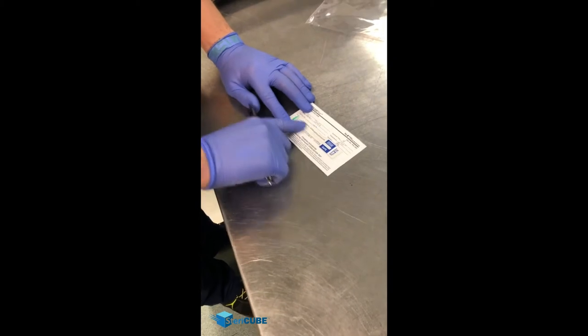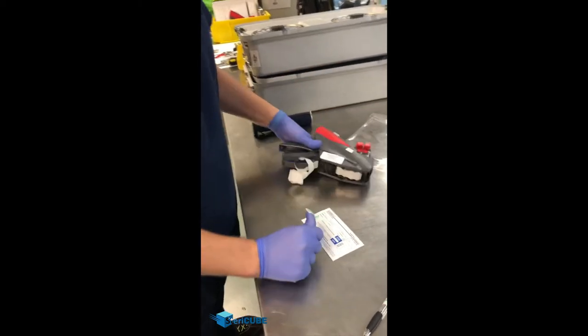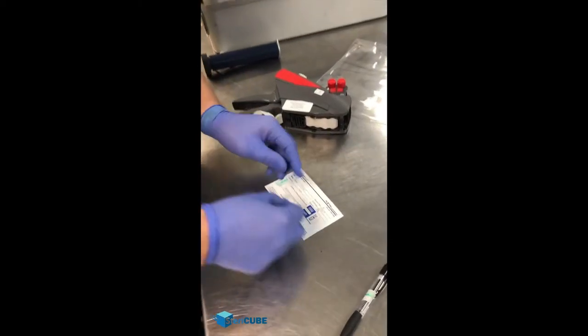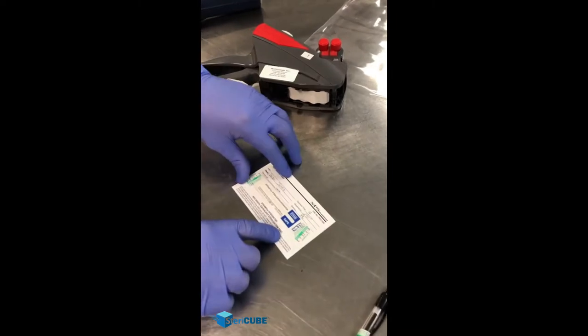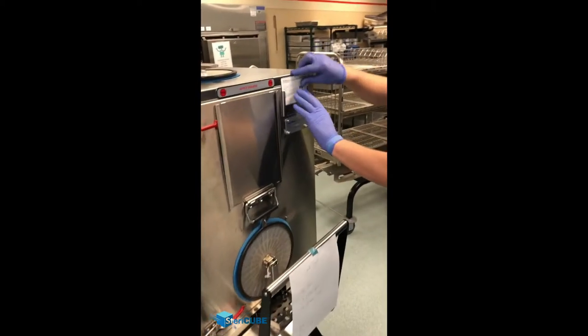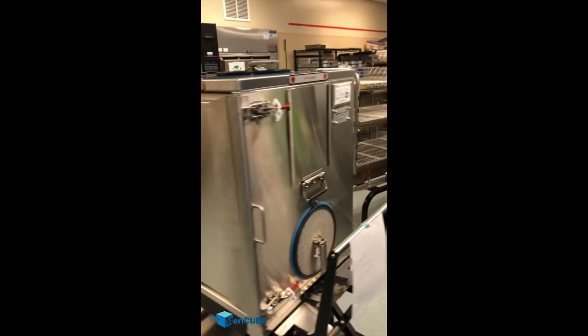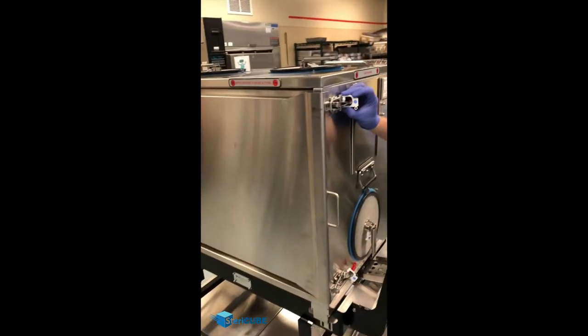I'm going to have an integrator here. Take a load sticker, just like we have here, and secure it down so it doesn't fall off during the sterilization process. Take your card and place it right here. Now you have your sheet, and our doors are locked.